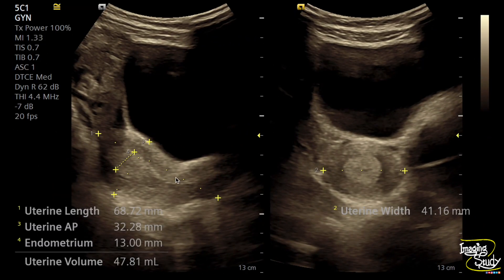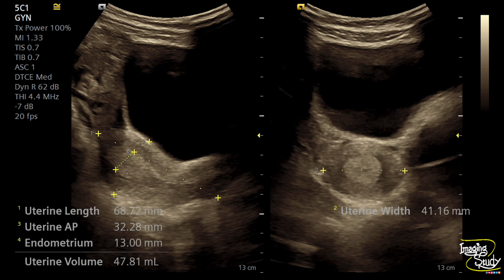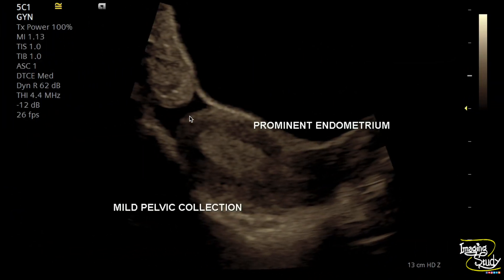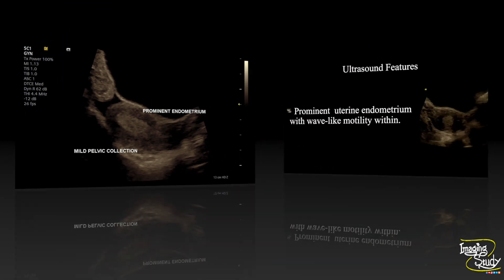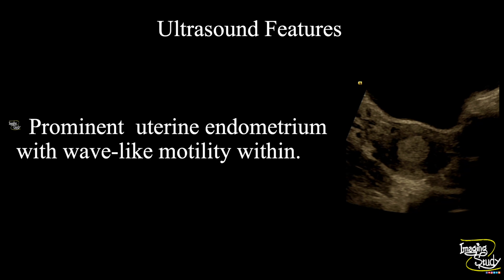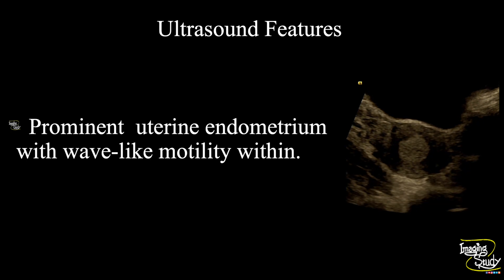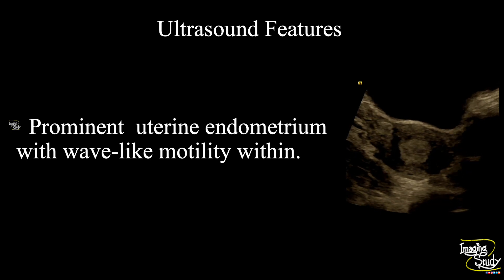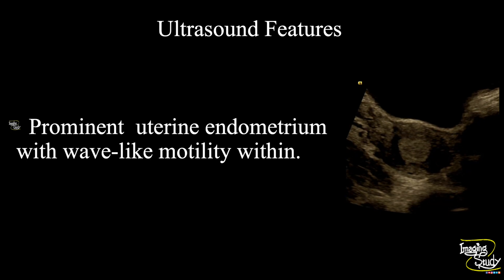Here is the picture. You can see the uterus is quite normal in size. The endometrial thickness is 13 mm, which is prominent for this age. And there was mild pelvic fluid collection. In summary, a prominent uterine endometrium is seen with wave-like motility within, indicating it to be endometrial waves.